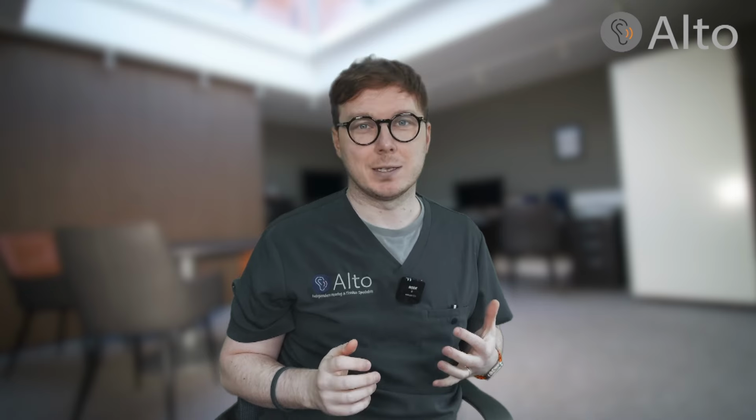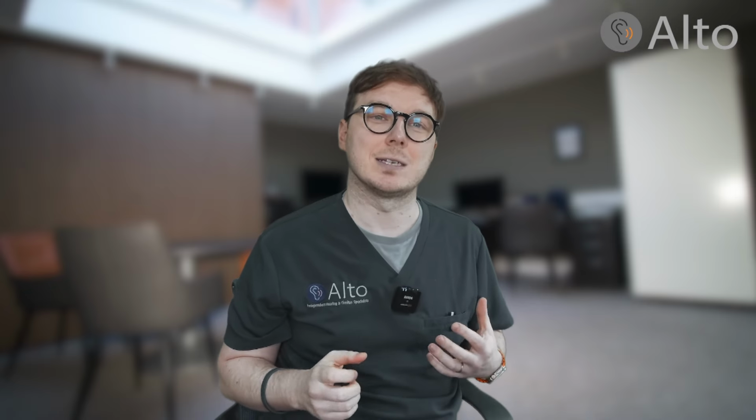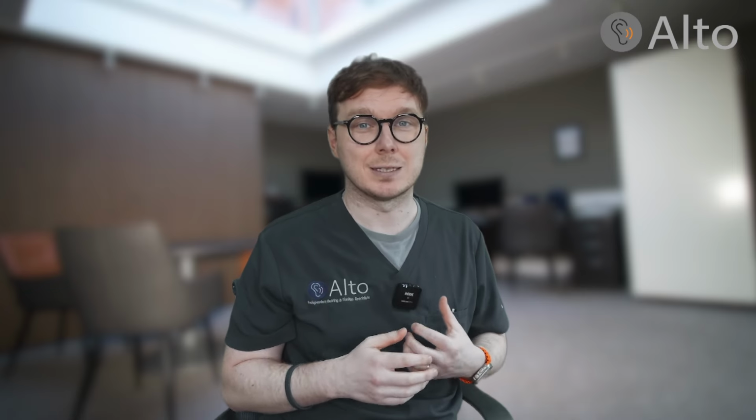Sometimes, despite our best efforts, landline calls can still pose a challenge. This is where considering an amplified telephone or one that's specifically designed to work with hearing aids can make a big difference. These specialised phones boost the sound, making it easier for you to hear, and they often come with other features that help. Swapping out your traditional landline for one of these models could enhance your ability to communicate over the phone drastically.